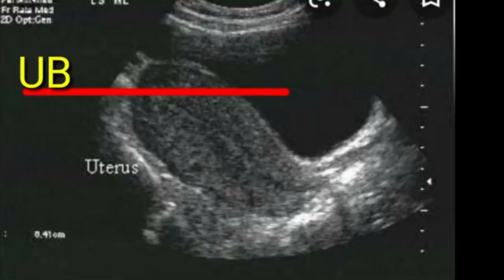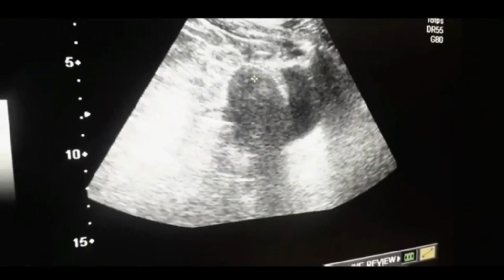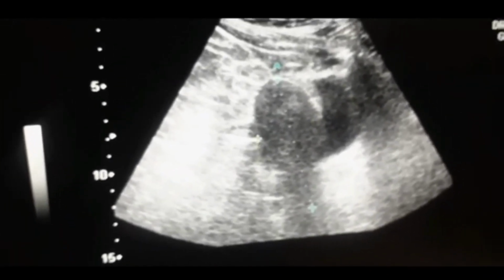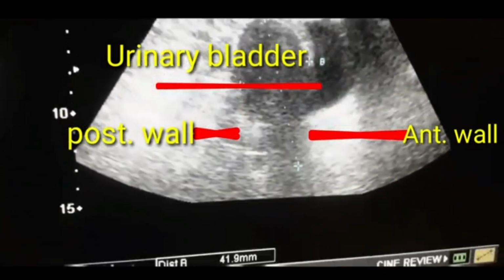In the picture, you can see the urinary bladder, anteverted uterus with the endometrium, and adnexa. So this is the live case about the anatomy of the uterus. This is the pelvic ultrasound of a 25-year-old female with the AV uterus, anteverted uterus, and this is the measurement of the uterus in the craniocaudal and the transverse position. Normal size of the uterus varies from 8 into 4 centimeters.